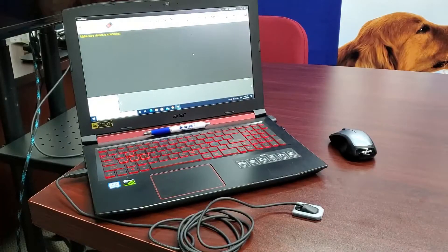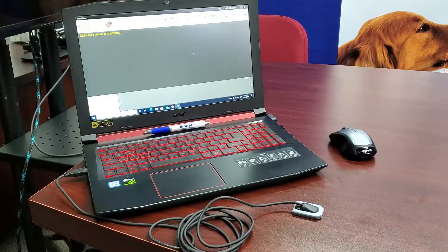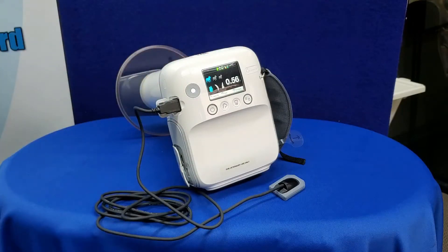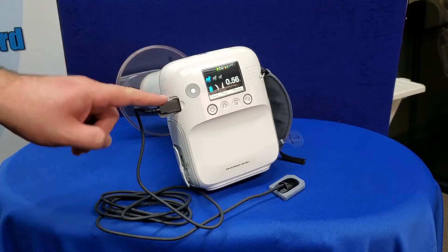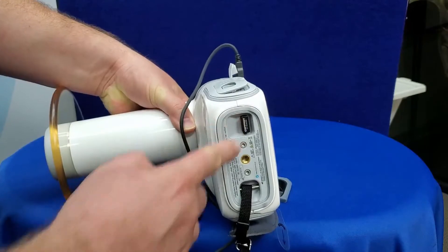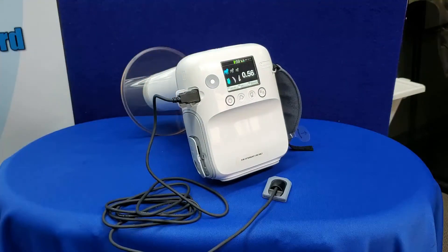Plug the PortView sensor into the PC for direct integration with your dental software. Plug the sensor directly into the Zen PX4 VET for image capture directly to the generator and upload to a PC at a later time. Or connect the sensor to your Zen PX4 VET and utilize the PX4 VET's Wi-Fi adapter for wireless transfer to your PC dental software.